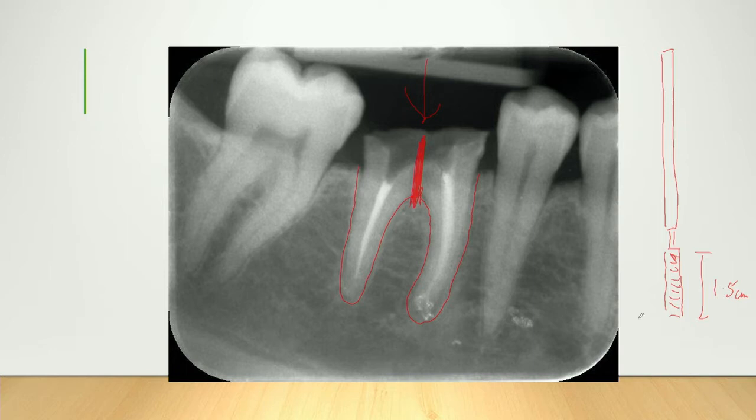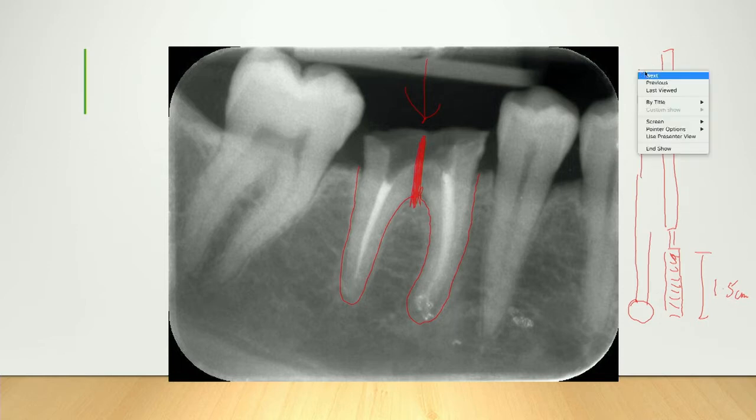If I'm doing wisdom teeth, I use a number 2 round burr, okay? Because that round burr will reduce the buccal bone, but for bone removal around roots, then I would use a straight handpiece or a contra angle with a tungsten carbide oral surgical burr and this kind of narrow shape. I don't like the tapered ones so much. There are tapered ones, but I like the flat ones.